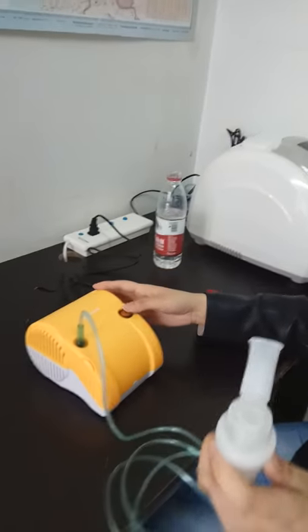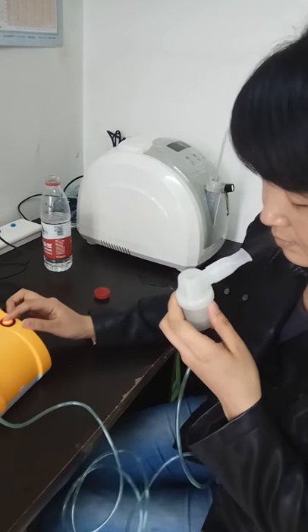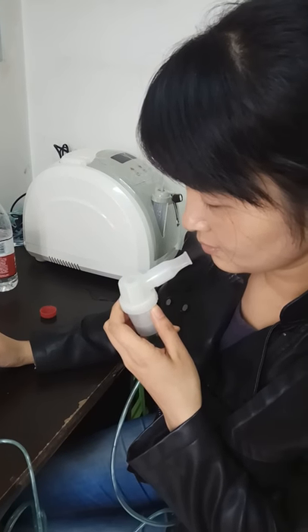Third, open the machine. You will find there is mist coming out.